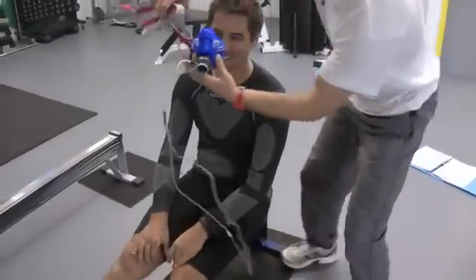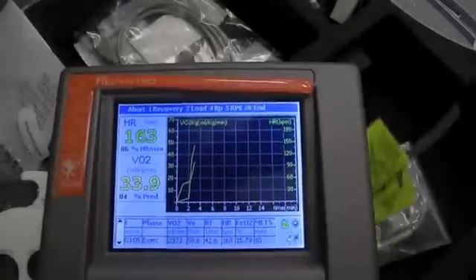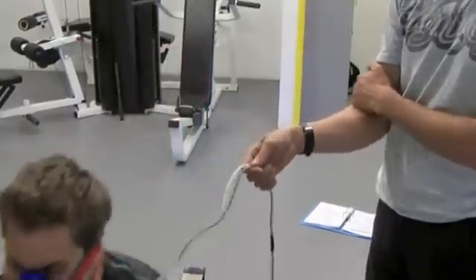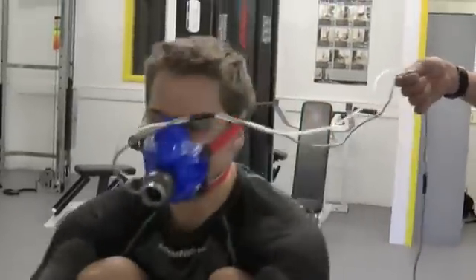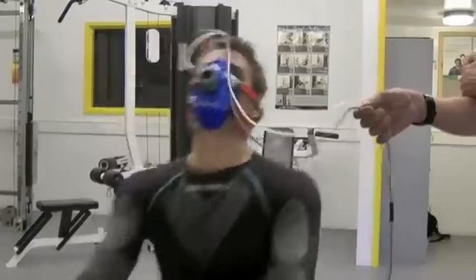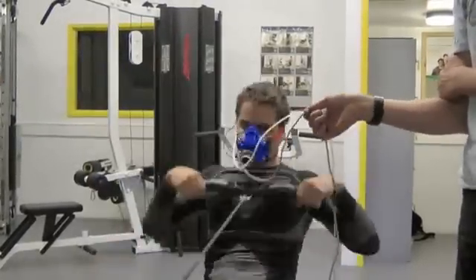Looking forward to it. Okay, let's get the mask on. Good, powering through. Looks good now. Keeping it in the 1.37 split.